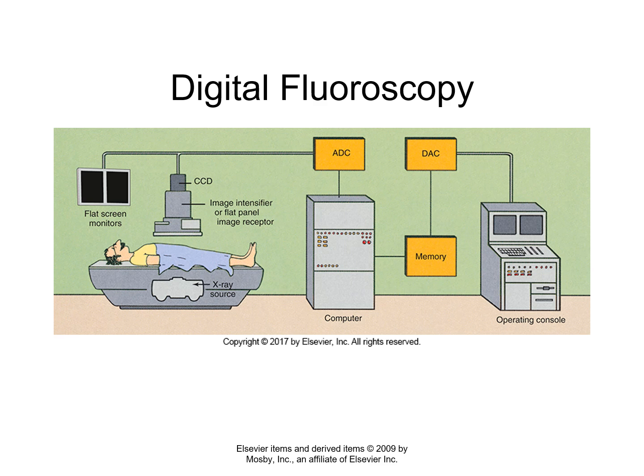Okay. So now it says image intensifier or flat panel image receptor. Now that's a flaw in Bouchon's diagram. What is important to know is if you switch to a flat panel, you don't need a CCD. The flat panel, third and fourth generation technology that you're going to talk about in digital imaging in detail, replaces the image intensifier and CCD. Okay? The CCD was replacing the conventional television camera. The CCD is your camera phone.